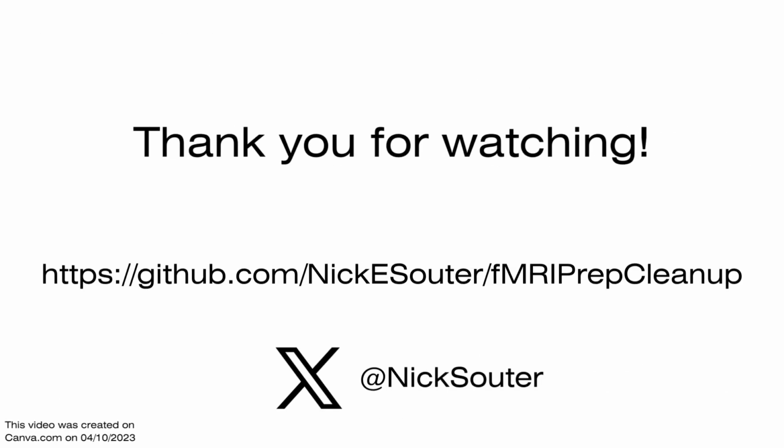Hopefully this video has given you a clearer idea of how to safely use fMRIPrepCleanup to tidy up your unneeded files. If anything is still a little unclear, please consult the README file on the GitHub page or raise an issue. I'll do my best to address it as soon as possible.